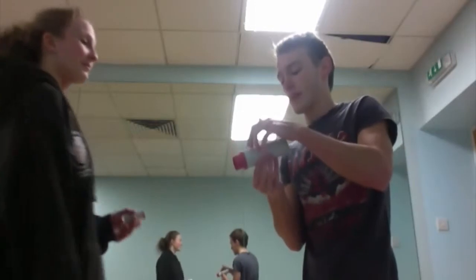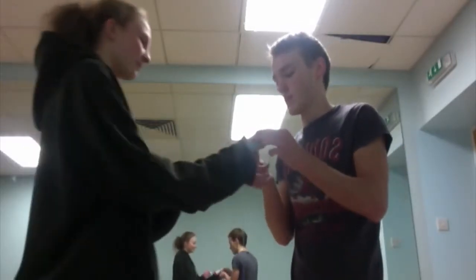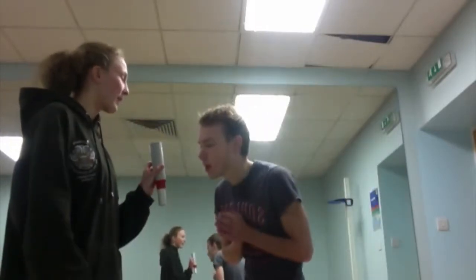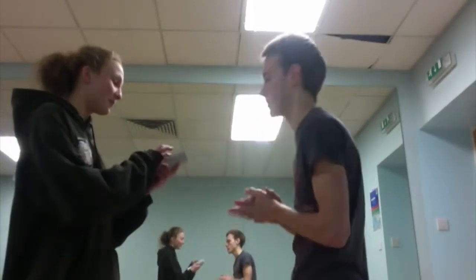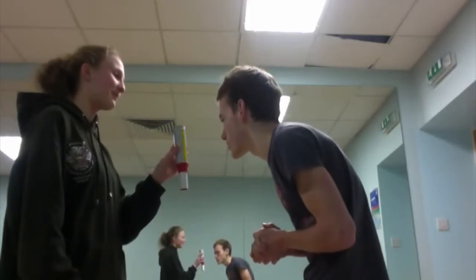If you could grab a cylinder tube, please — I can't touch it for health and safety reasons. Make sure it's reset and pop the cylinder tube in. Make sure it's nice and tight and blow three times. First score: 290. Reset it — 290 again. One more time — that's 280. So we got two 290s and a 280.